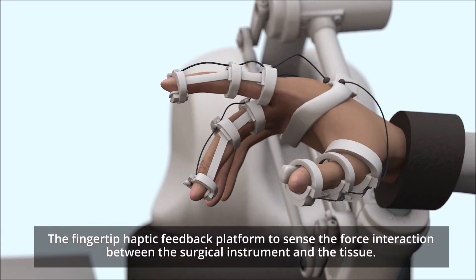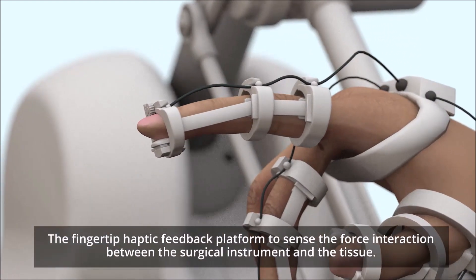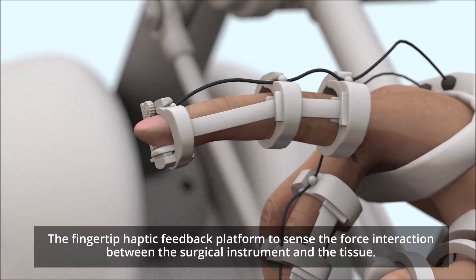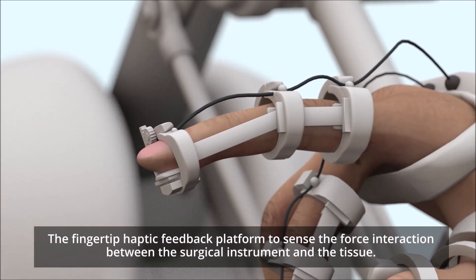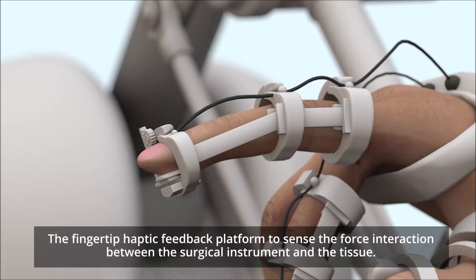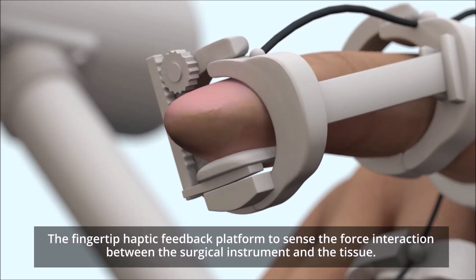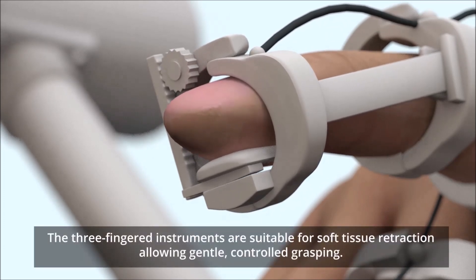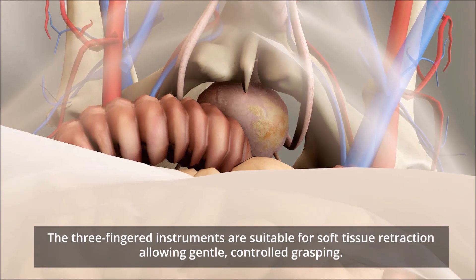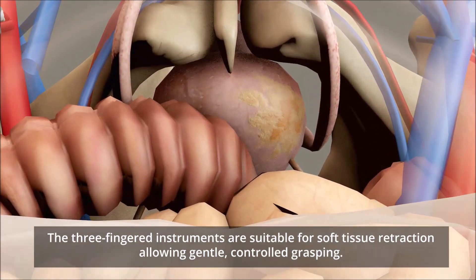The fingertip haptic feedback platform senses the force interaction between the surgical instrument and the tissue. The three-fingered instruments are suitable for soft tissue retraction, allowing gentle, controlled grasping.